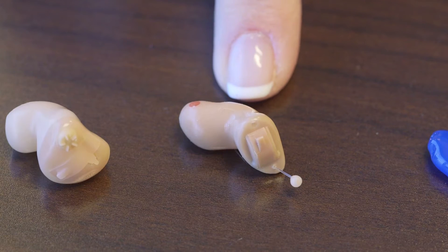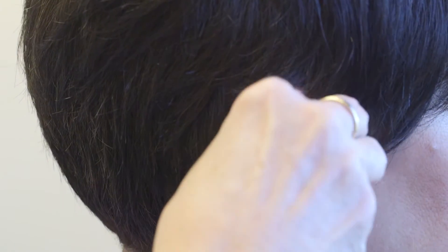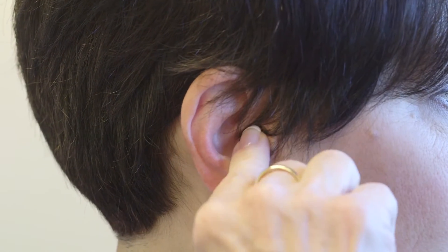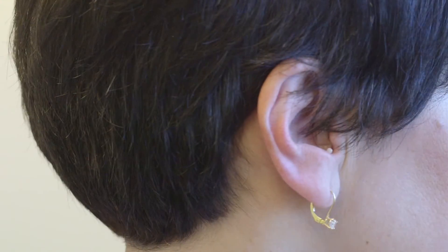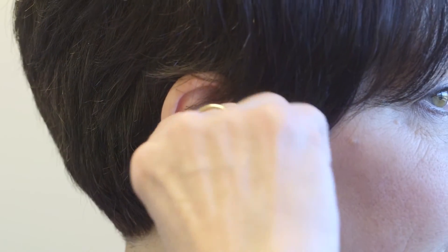The smallest hearing aid is called a completely-in-the-canal hearing aid, where the device is small and contained within the ear canal. Once in place, it is very difficult to see. You use a little string to pull it out.